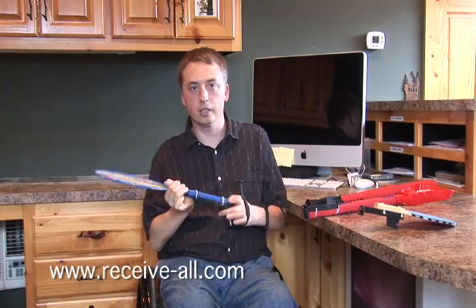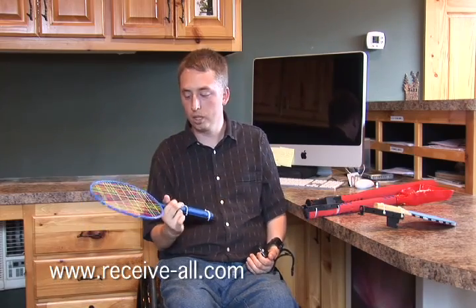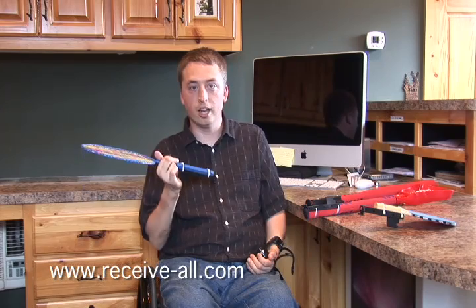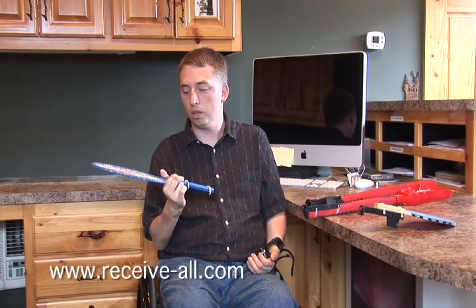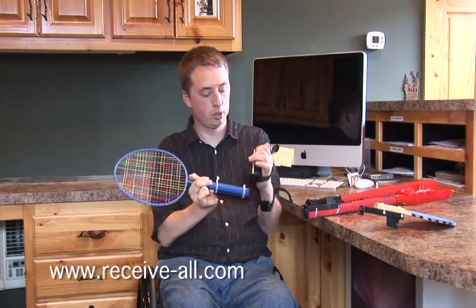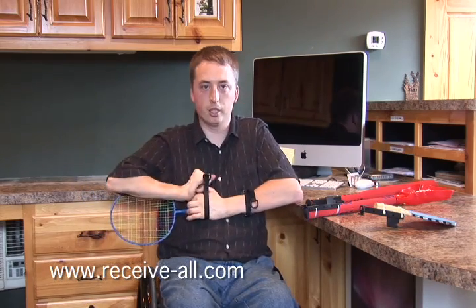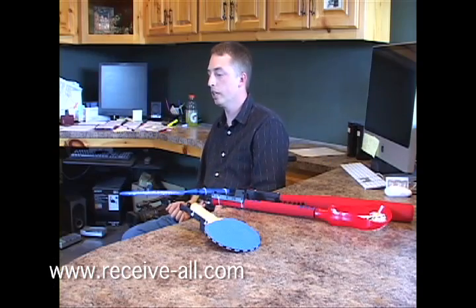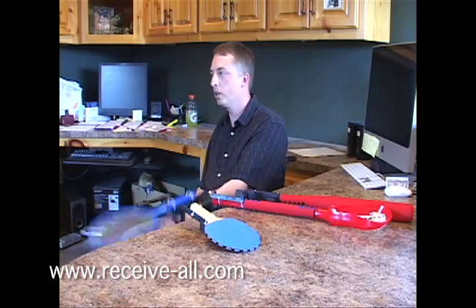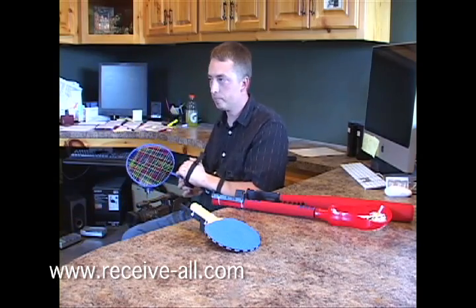And another thing that we have had shown to us, we thought it was a great idea, was a badminton racket, where you can have balloons instead of the regular items that are used in badminton. A balloon is a lot slower, so the kid can have this racket attached to their hand and forearm, and now they can go and participate again.